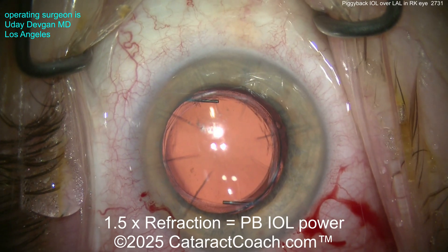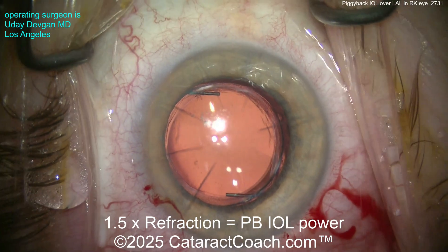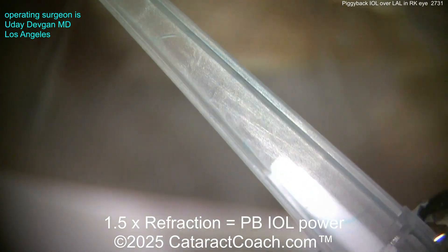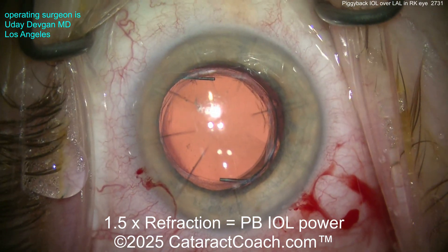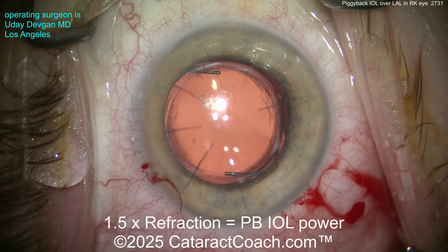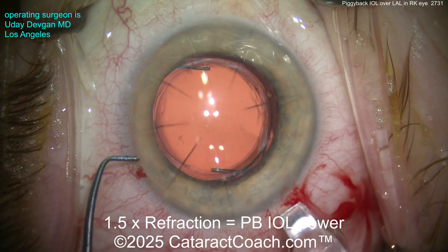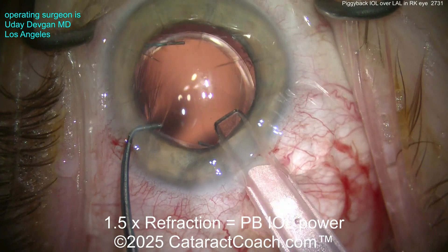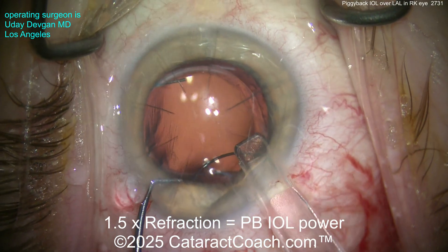The lens is in the capsular bag, and the problem is this: when you do cataract surgery on a patient with RK, look at the pre-op K values. Let's say pre-op the K values are 33. You do the cataract surgery, and post-op on day one the K values are 31. That's okay — you have to wait. Sometimes it takes a month, two, or three for the K power to go back to 33, whatever the baseline was.